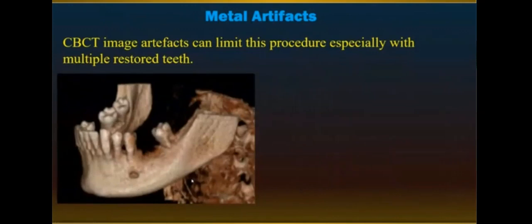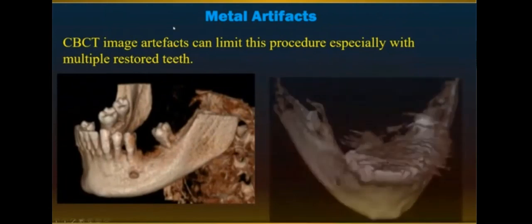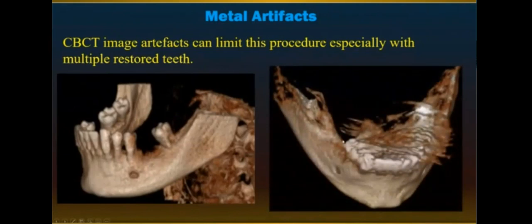And all the machines, whether the cheaper ones, the expensive ones, the high quality or the low quality, will give like similar or very near quality to each other. The problem is when the patient has metals, you will have here multiple artifacts which obscure the visibility and makes some readings, especially in the bone quality, may be altered.